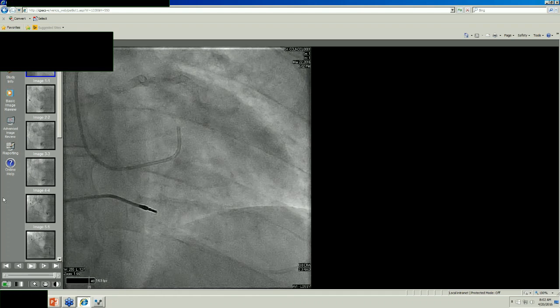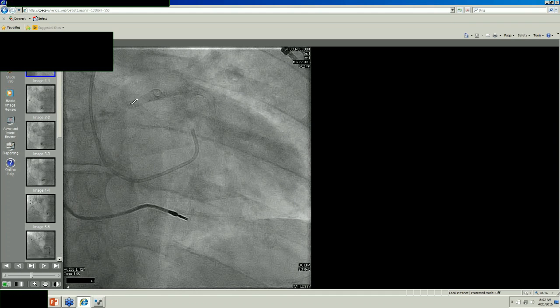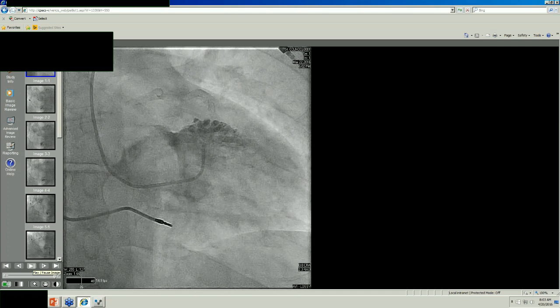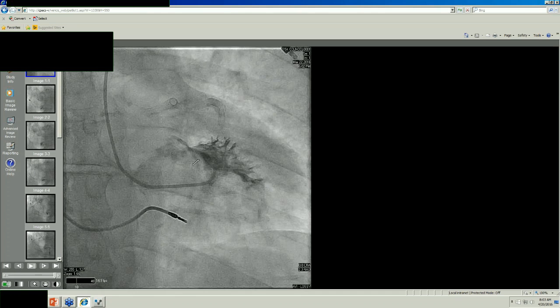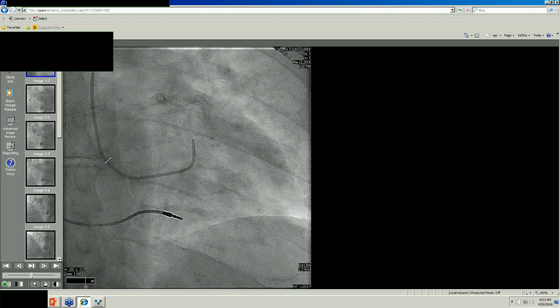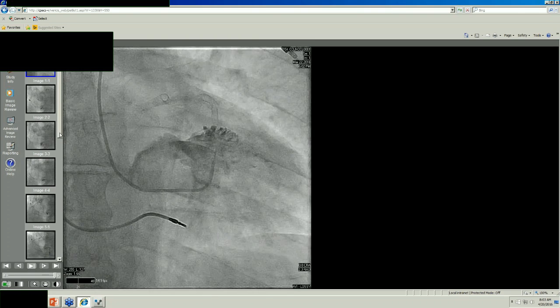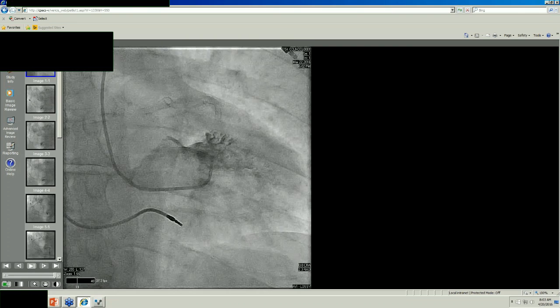Let's look at the other cardiac cath. So here's the repeat cardiac cath within, I guess, 6 months. Here's the stent going into the circumflex, stent going to the LAD, 2 stents, the stent extending maybe just into the opening of the main left. This is a catheter that fell across into the LV and said, hey, we got to cross anyway because the insurance company will pay for it. And then if you inject some dye, the insurance company will pay for that too, so we got to do that too. So it's just sort of a token because we have all the information from the echo and don't even need to do any of that.